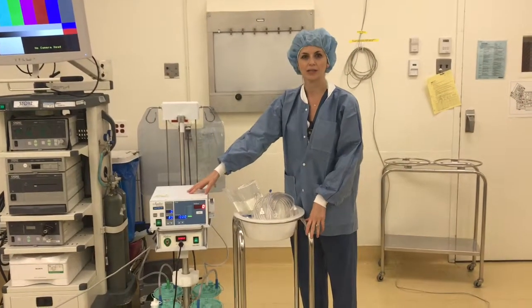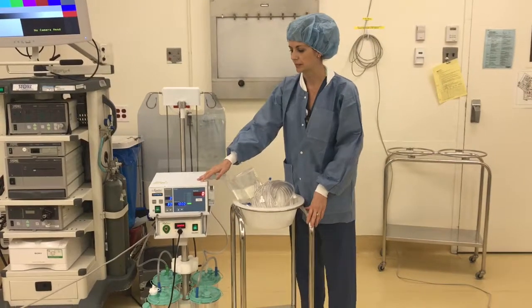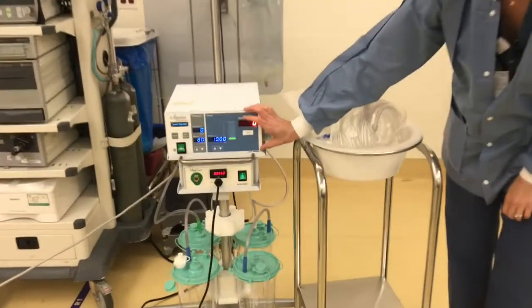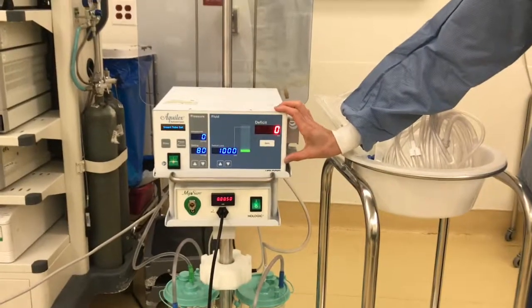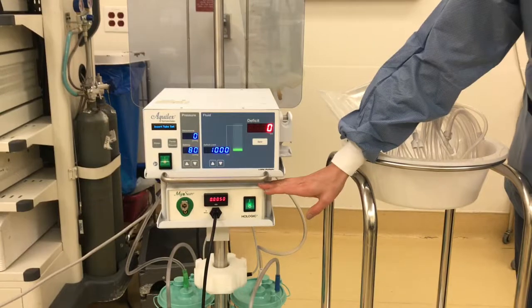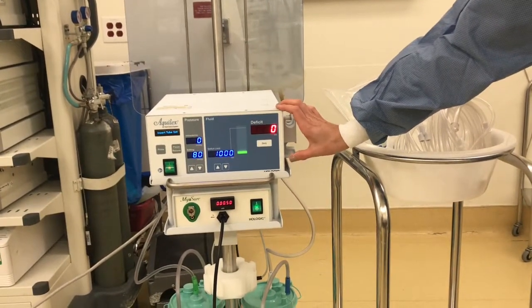So we have our Aquilex system. This is our fluid management system for our hysteroscopies. The top part, the Aquilex, is for fluid management only. The bottom part is the MyoSure, which we would do if the surgeon was doing a polypectomy. So we're going to focus mostly on the fluid management system.